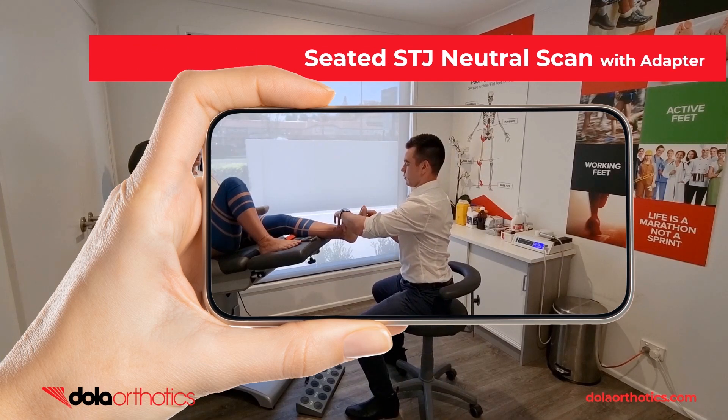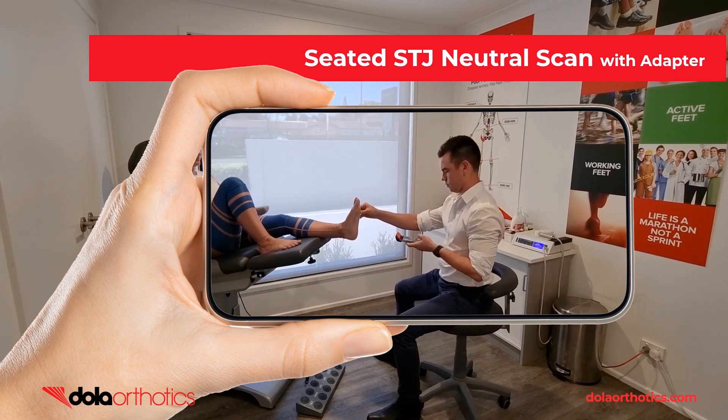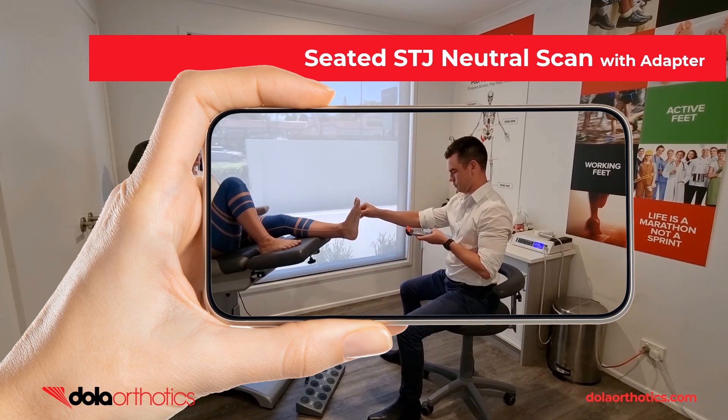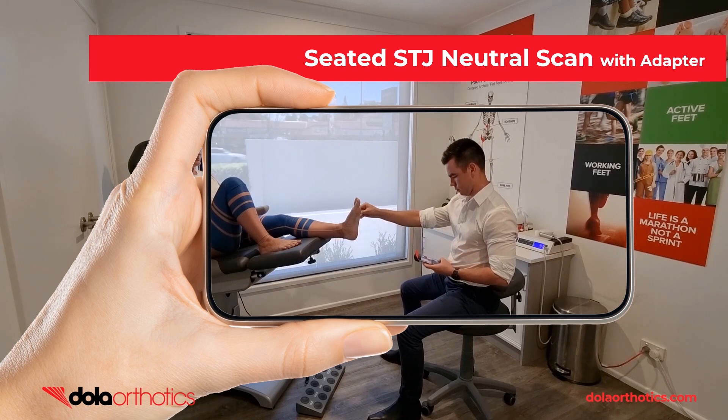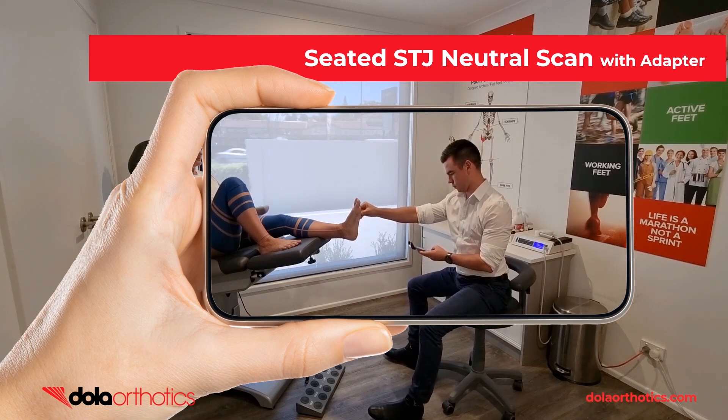Here is a demonstration of the iPhone with the Dollar iScan adapter being used to scan the foot with the patient in a seated position. The clinician is able to hold the foot in subtalar joint neutral just like completing a traditional supine plaster cast while completing the scan. The adapter provides easier visualization of the screen during the scanning process, allowing the clinician to remain seated.